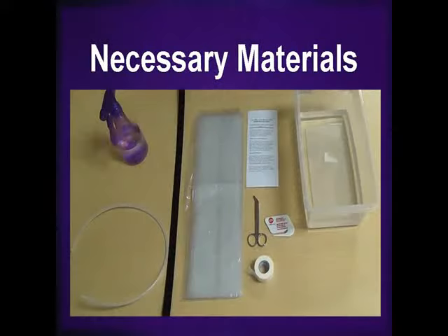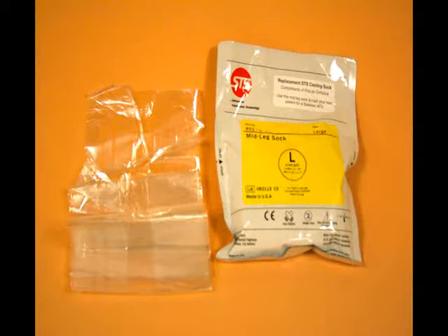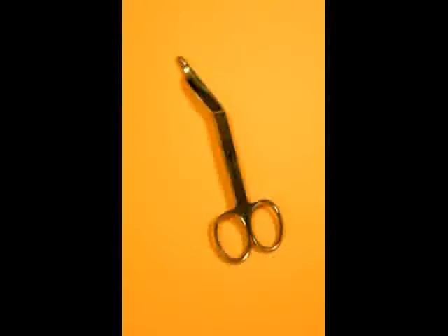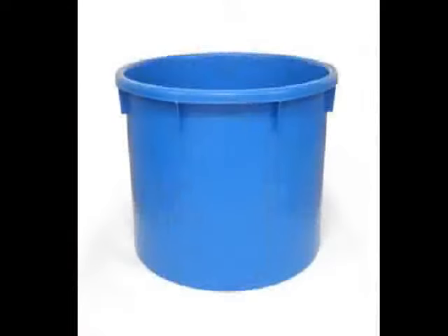There is a list of materials that are necessary to properly apply a negative cast. They include a spray bottle filled with clear water, a channel tube, and a protective strip which is included in the STS box, an actual STS sock and baggie that matches the shoe size of the particular patient you're casting, a pair of latex gloves, a small bandage scissor, a letter opener for removal of the cast, a roll of paper tape, and also a bucket of cool, clean water.